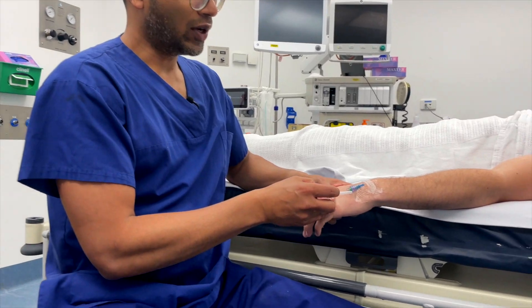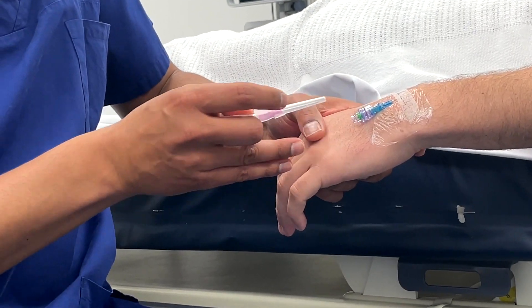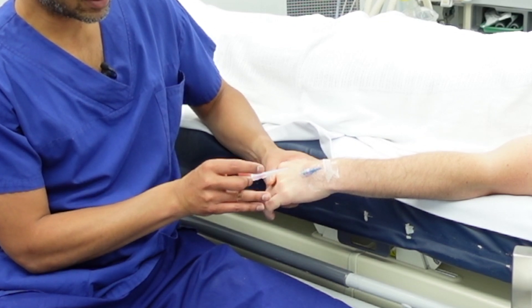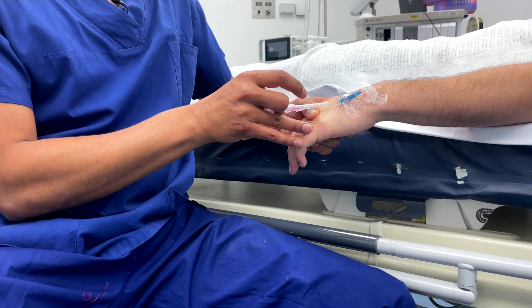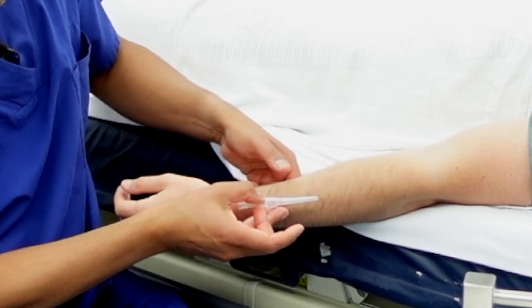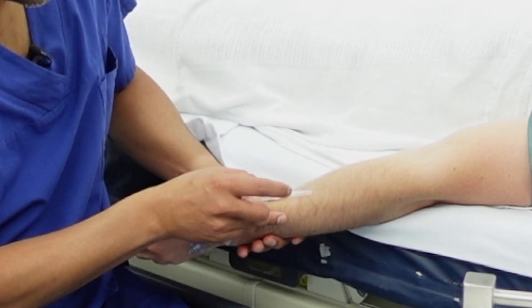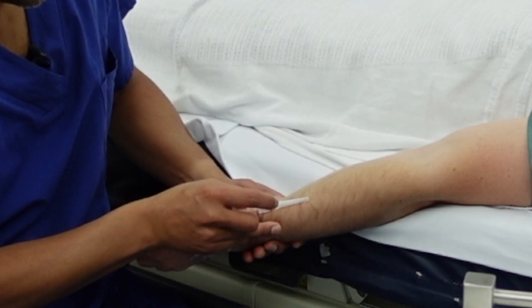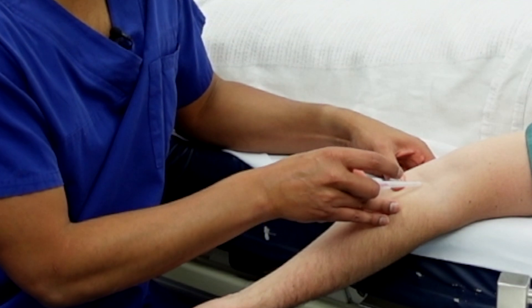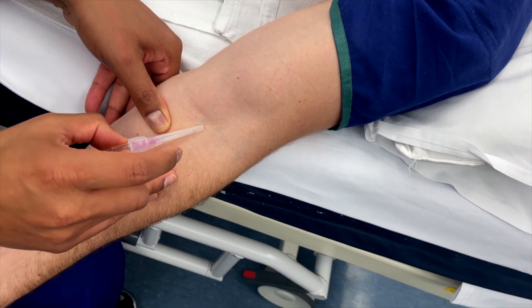This is my technique for holding any cannula — for the most difficult veins you want to make sure all your structures align with minimal movement. When I put tension on the skin I make sure the thumb never gets in the way of my low angle — that low angle is absolutely vital to avoid cutting the wrong surface of the vein. Say I had a vein here, I wouldn't put my thumb there; I'd put it over the knuckle edge so once I've got flashback I can lower down. If my thumb is in the way I just can't lower down enough and I'm at risk of puncturing the deep surface of the vein.